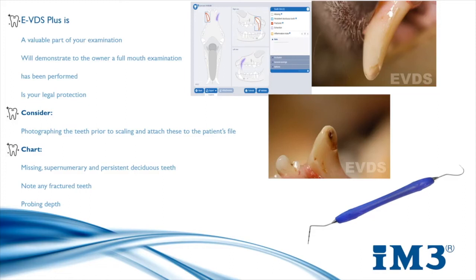Continue to chart and note any supernumerary and persistent deciduous teeth. And most importantly, in order to know what is supernumerary, you must remember how many teeth there should be.